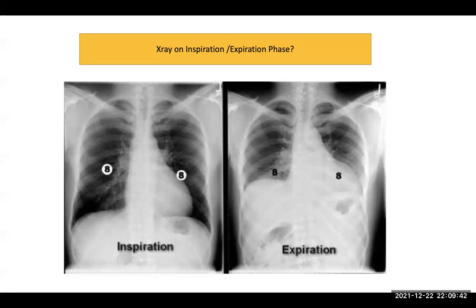Invariably, I found in my center, where I practice in a rural area, that patients sometimes come with the X-ray in the expiration phase. When I asked the patient whether the technician told them in the X-ray room to take a deep breath and hold it, most of the patients told me no, they had no such direction.